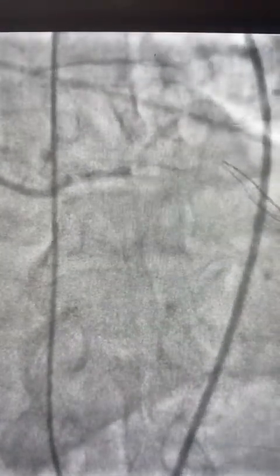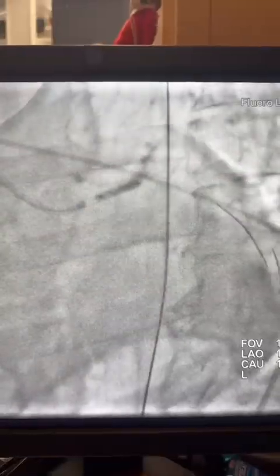This is a JL guide catheter, JL-4, and then there is a run-through wire. Here is the first balloon to ostium — 2.0 — then upgraded to a 3.0 NC balloon, and then Shockwave 3.5.